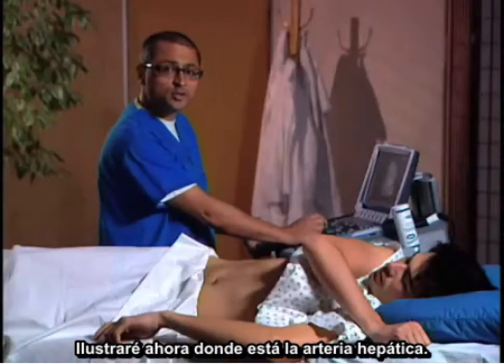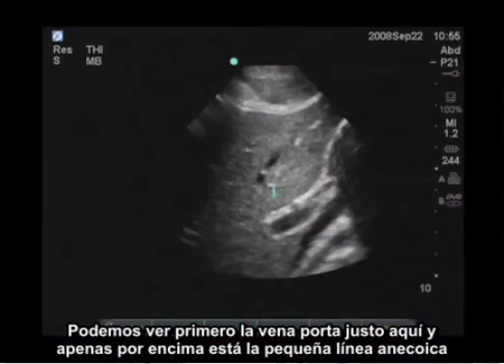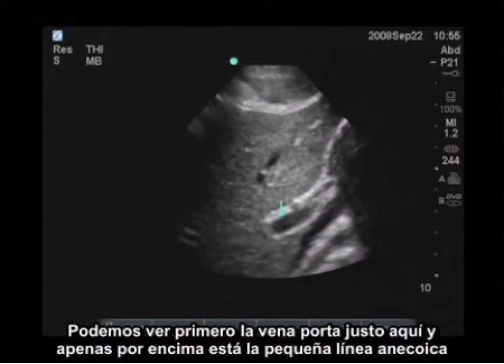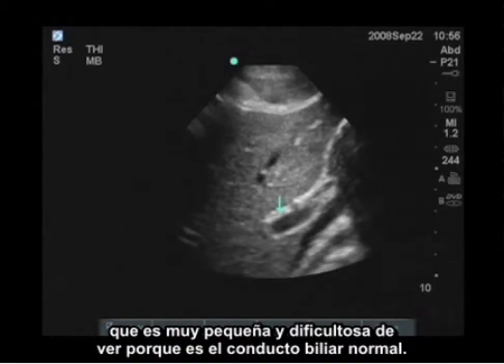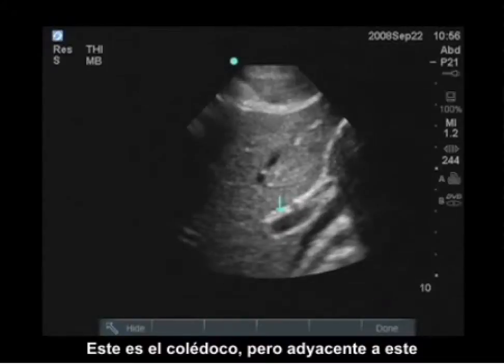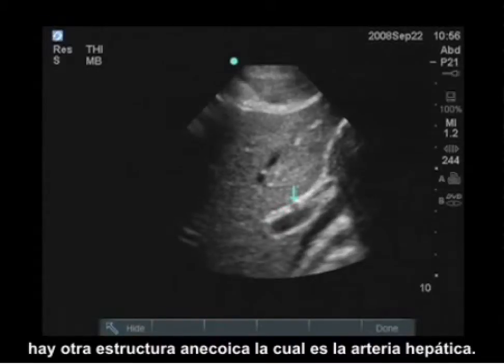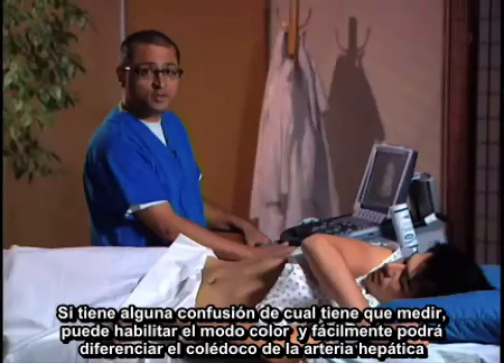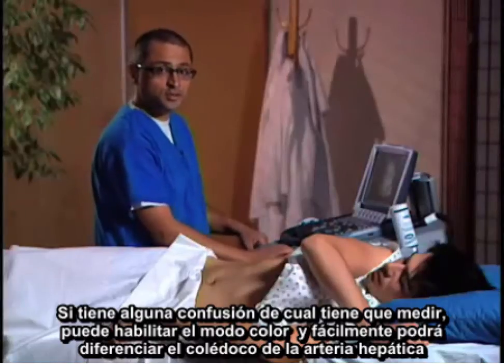I'm going to illustrate where the hepatic artery is. This is the portal vein right here. Right above it is that little anechoic stripe, very tiny and difficult to see because this bile duct is normal — this is the common bile duct. Right adjacent to it is another anechoic structure, which is the hepatic artery. If there's ever any confusion about what you're measuring, you can easily turn the color flow on to differentiate the two.